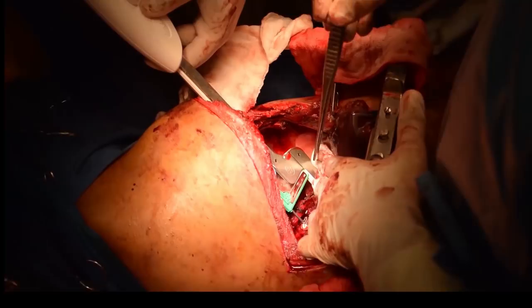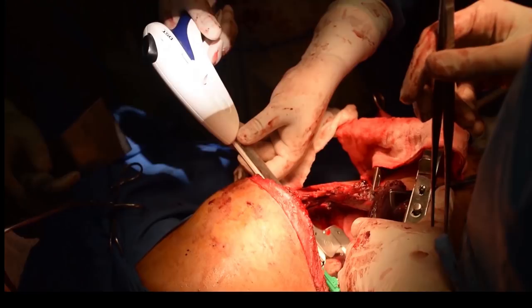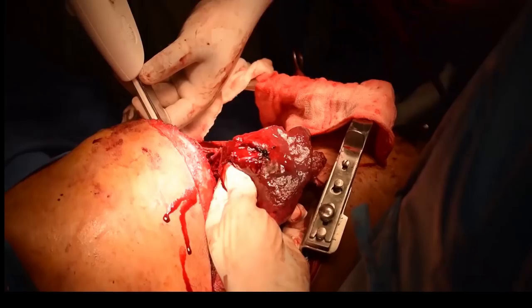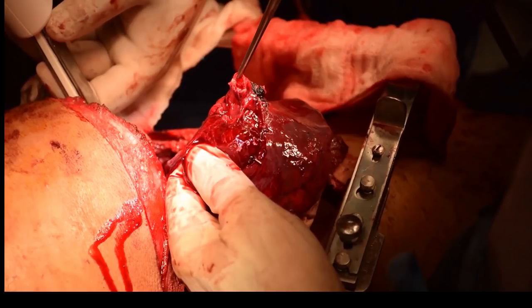This is showing the stapler being used. After stapling, the bronchus was divided and the specimen removed, showing the division of the bronchus. That is the specimen — the bronchus to the lower lobe — you can see it very clearly.